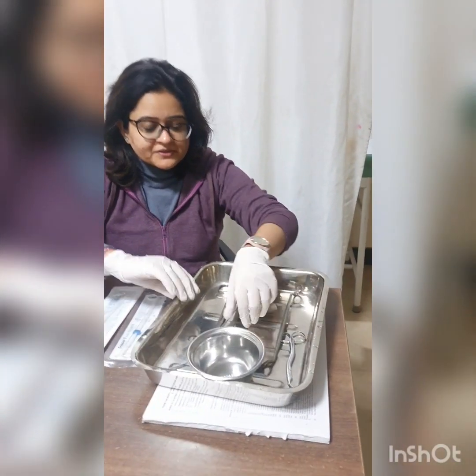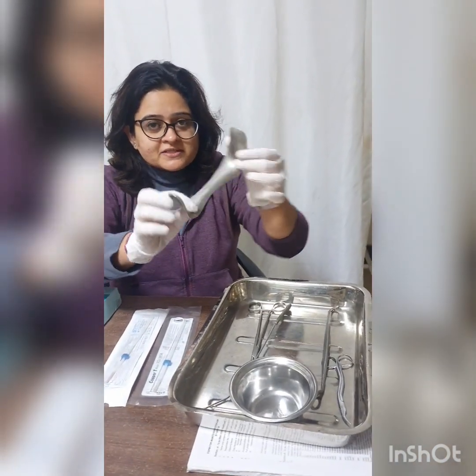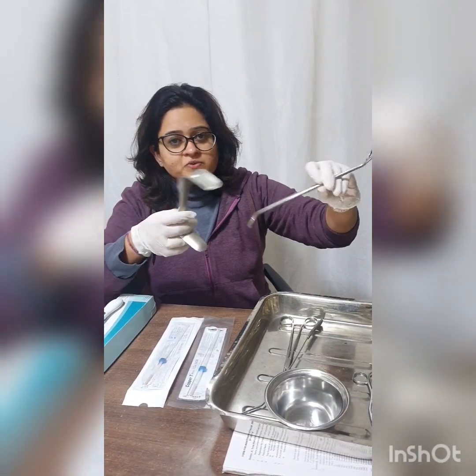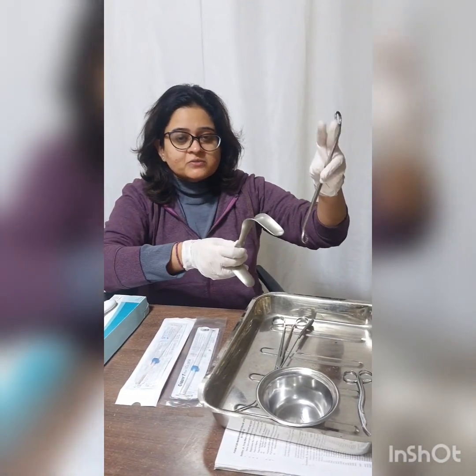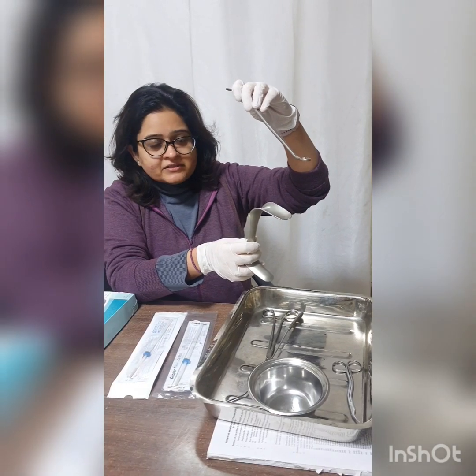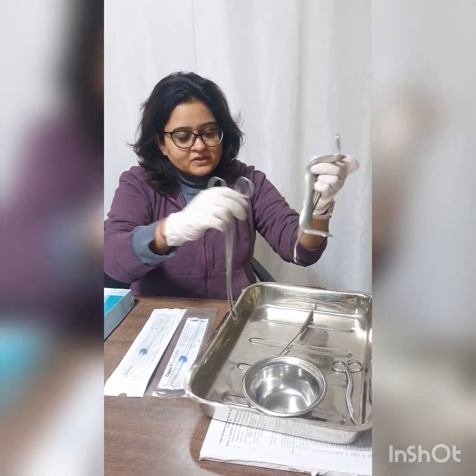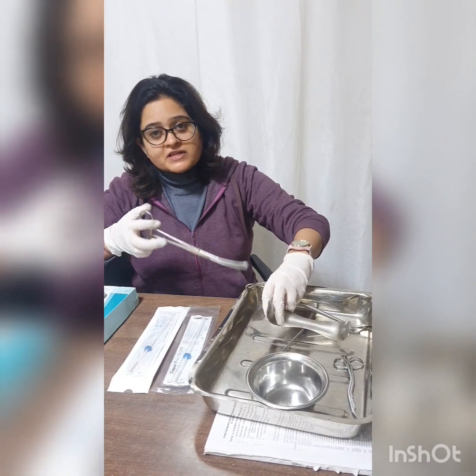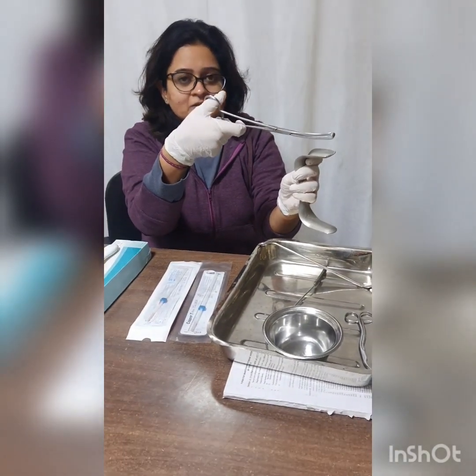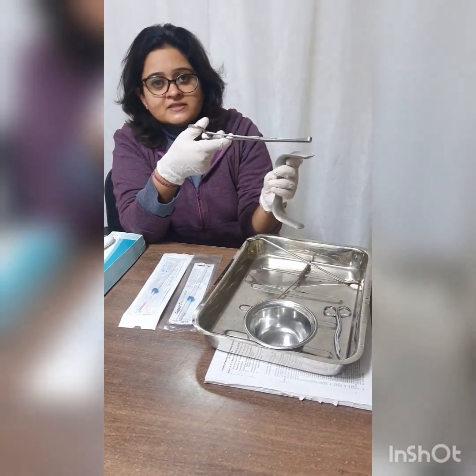These are the instruments that are required. We have a Sims speculum and an anterior vaginal wall retractor. We insert the speculum in the vagina and retract the anterior vaginal wall with the AV retractor. We then visualize the cervix and hold the anterior lip of the cervix with the vulsellum.